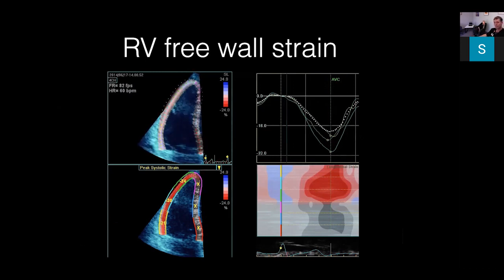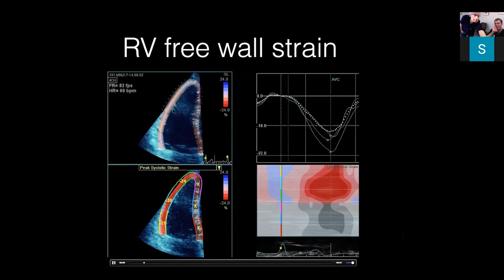But when you're actually creating the width of the image, isn't it supposed to be overlying the whole image? Do you mean the width of the whole image, or just the width of the region of interest? The region of interest, the middle bit of the muscle. You're meant to try and cover 95% of the myocardium, from the inside to the outside.